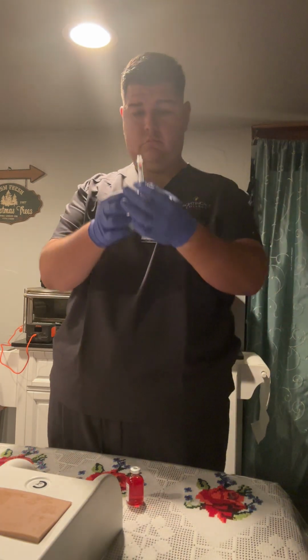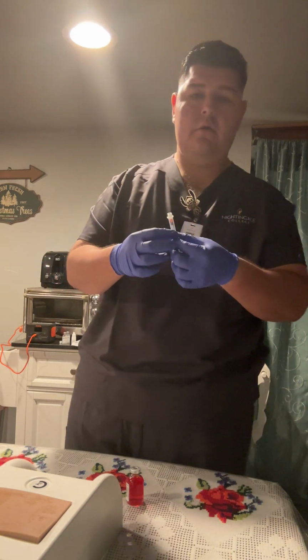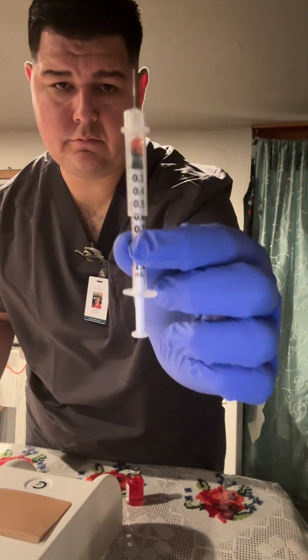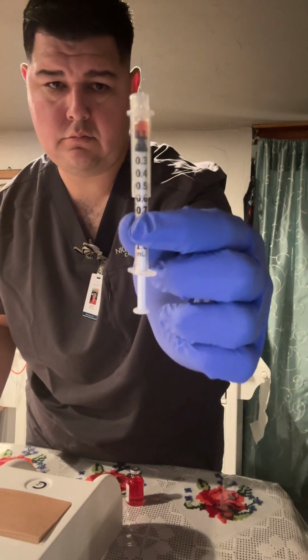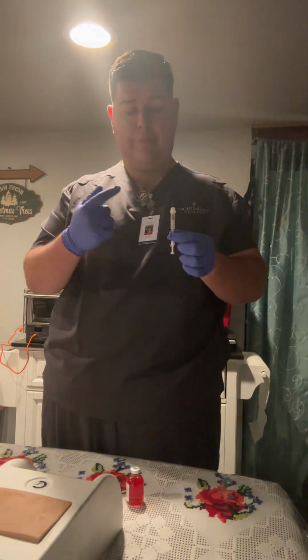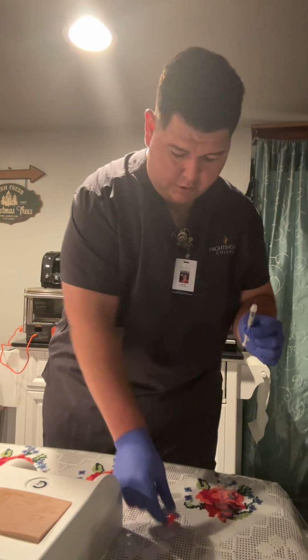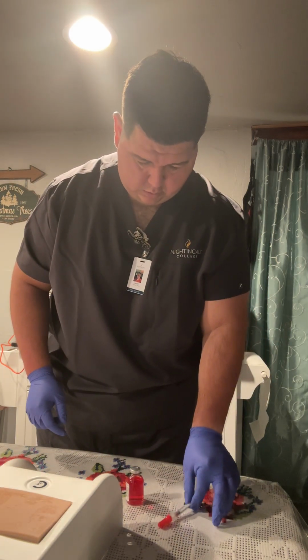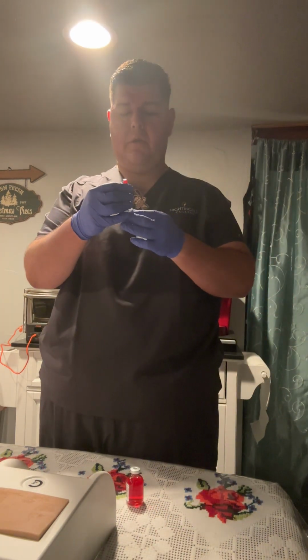Okay. Just double checking. I'll place my vial back on the table. I'll show you the 0.01. Oh, you can see that there. So, ideally, once I remove the syringe from the vial, I want to recap it almost immediately, using the swoop method, where we swoop the lid. So I will go ahead and swoop, and place my cap back on.